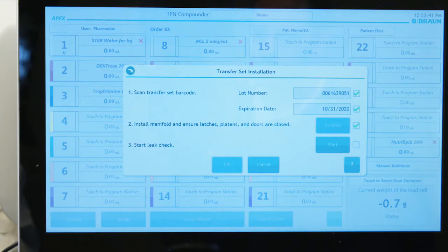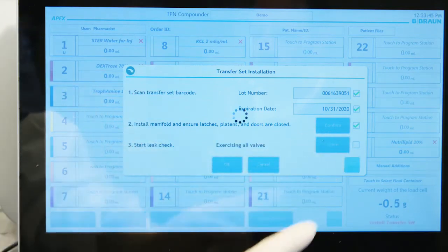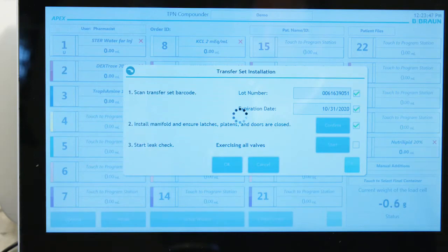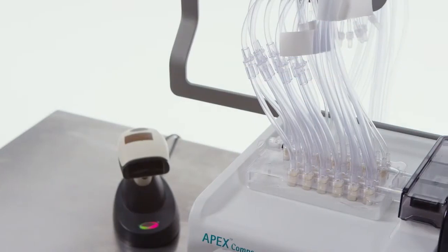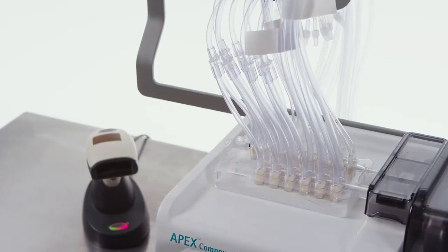Tap start to start the leak check. In the first part of the leak check, APEX will display the message exercising all valves while it rotates each valve of the transfer set. This step will take approximately two minutes.